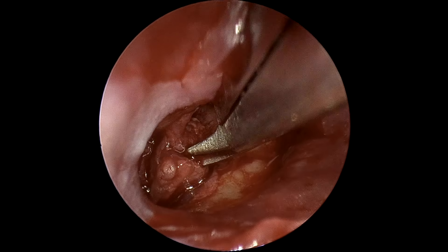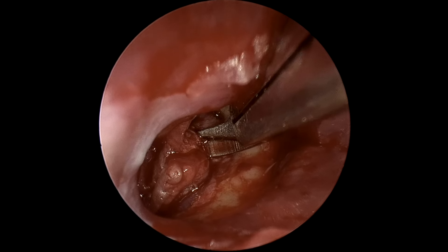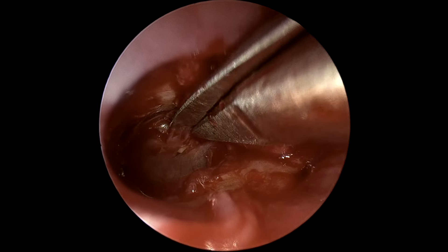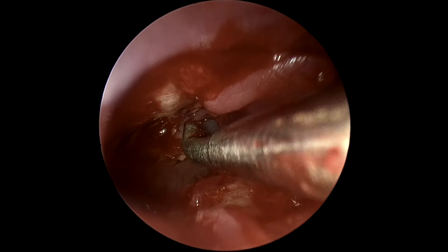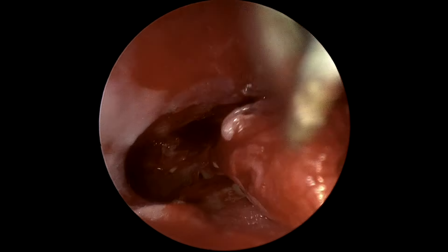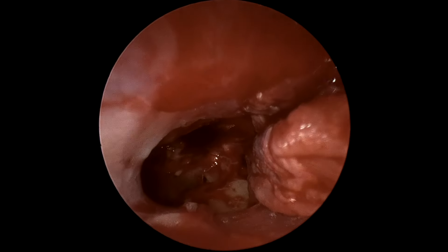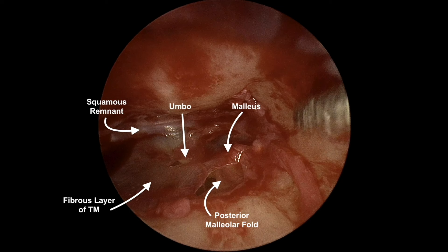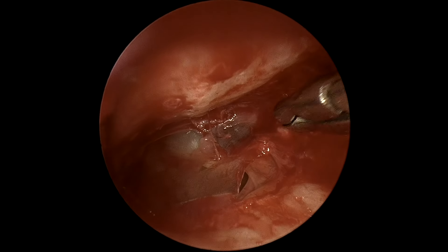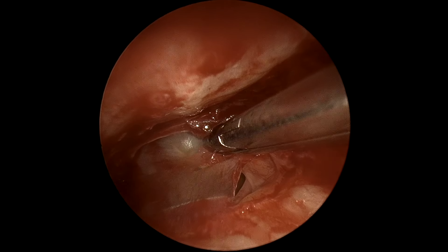The scissor is used to again release some of the tougher areas. After this layer is finally removed, one can see the fibrous layer with a few small expected perforations from dissection. One can see the malleus and umbo, as well as the posterior malleolar fold. There is an anterosuperior squamous remnant that is particularly tenacious; this will serve as a lip to slide our graft under. A small squamous remnant is removed from the center to prevent cholesteatoma formation.